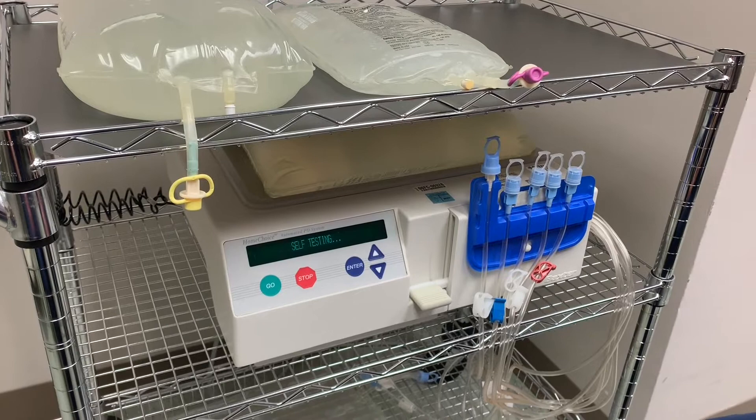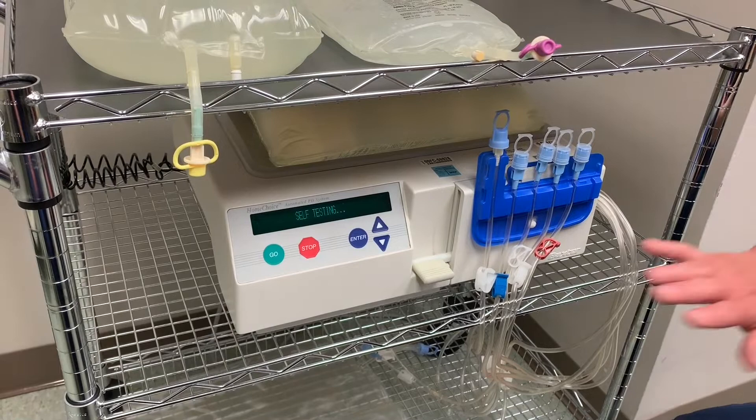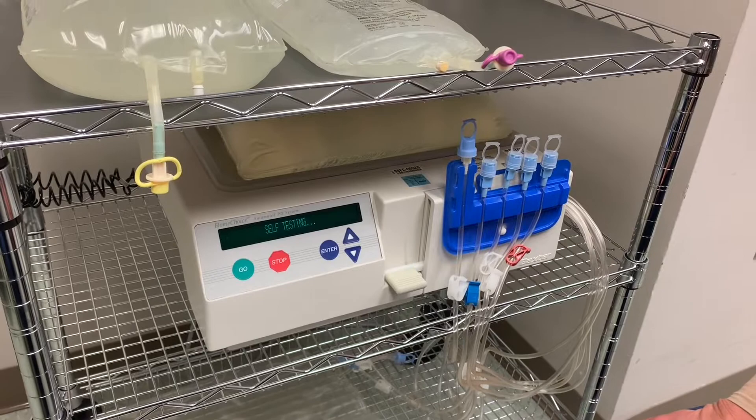Press Go again and the machine will go through self-testing. You'll hear the door tighten and close around the cassette — it's testing the integrity of the cassette to make sure there are no holes in it.